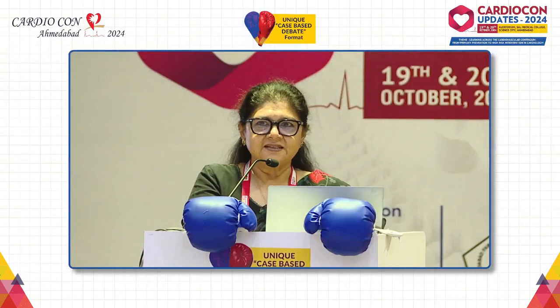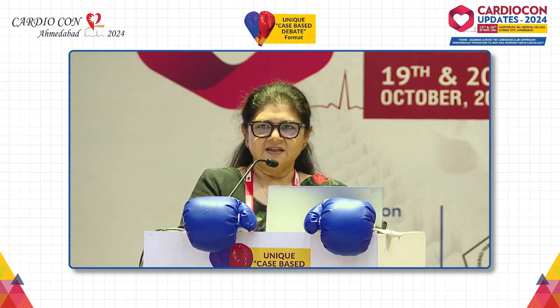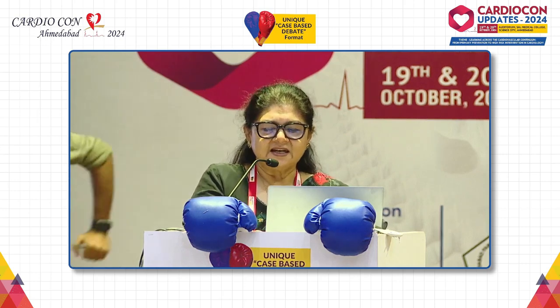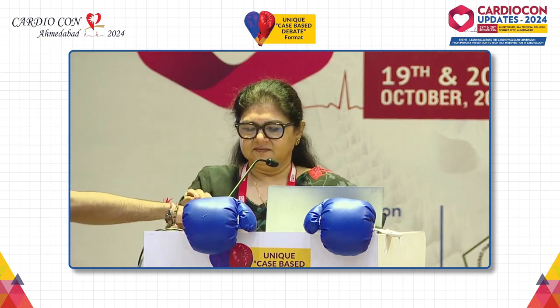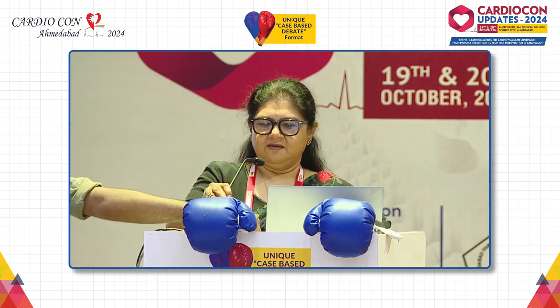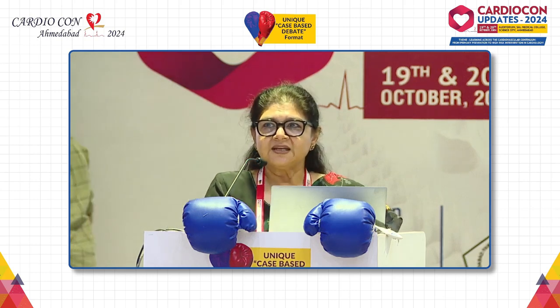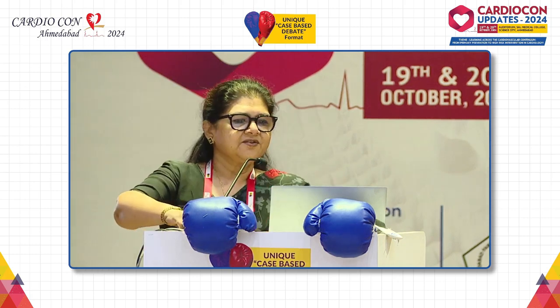So this again is the mechanism of action of a drug-coated balloon. The drug is coated on the balloon, and when it comes in contact with the vessel intima and media, the drug gets delivered into the system. So why do you need a DCB in a bifurcation lesion? What is the treatment?